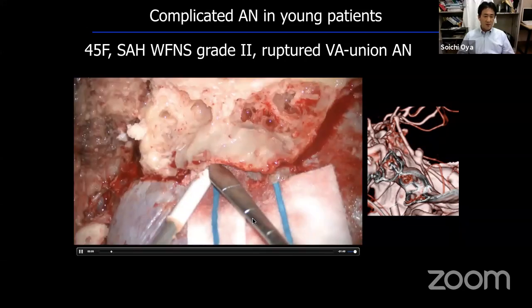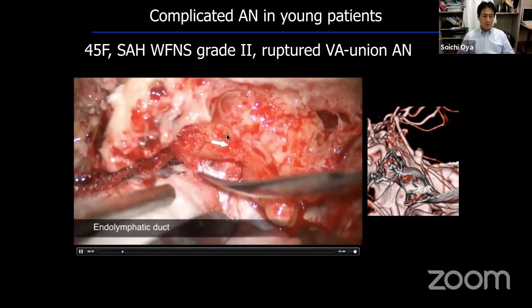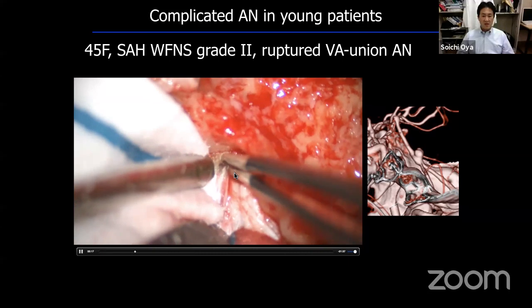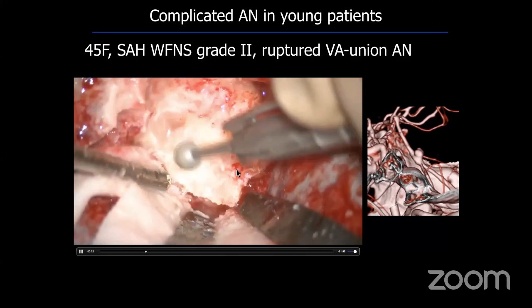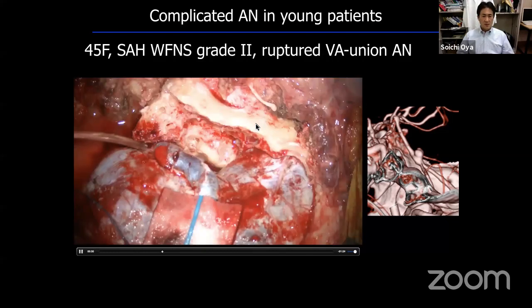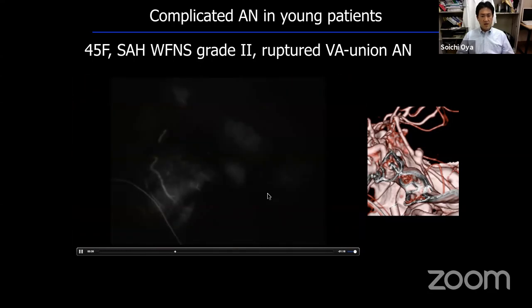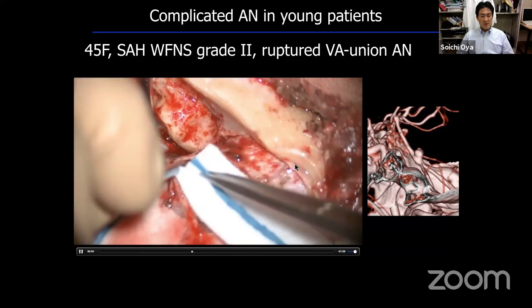I'm starting with a mastoidectomy. This is the antrum. And this is the endolymphatic sac. I coagulate the orifice of the endolymphatic sac, and I cut it. And this is the lateral semicircular canal, the posterior semicircular canal, and the superior semicircular canal. And I drilled the tip of the bone here. And now I'm confirming. You see here, this is the sigmoid sinus, which is patent.